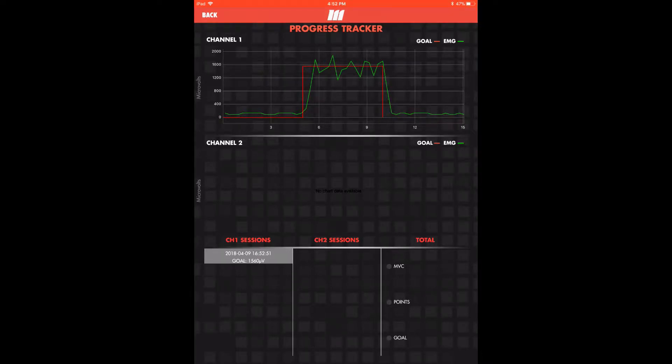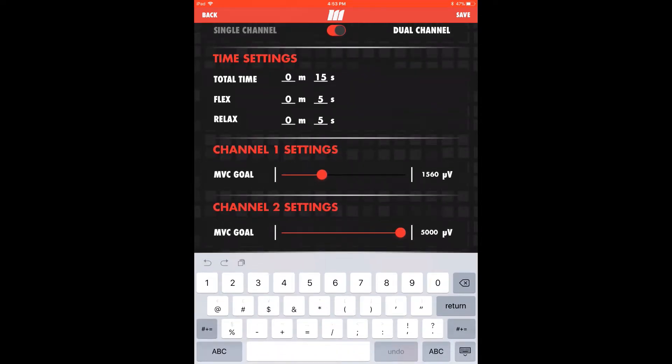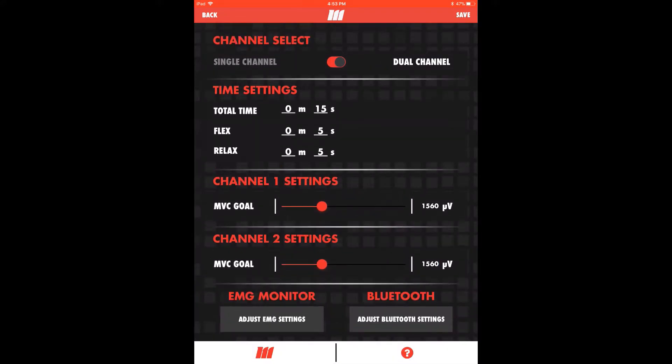We'll now move into the demonstration of dual channel monitoring. This setting is commonly used to compare the involved side to the performance of the healthy side. It is also applicable for monitoring co-contractions. The only setting we need to adjust is the channel 2 MVC goal. For involved to healthy comparison, we set the goals exactly the same. The goal can also be set by tapping on the microvolt number and typing in the exact desired goal.